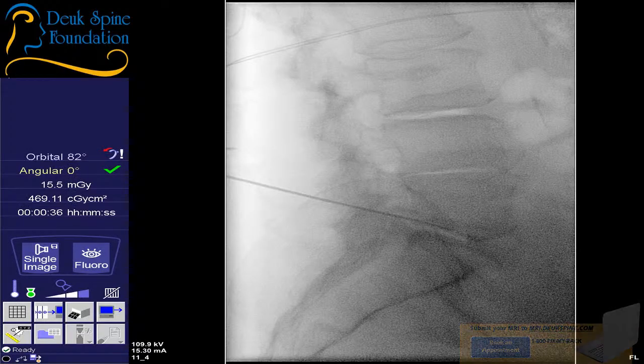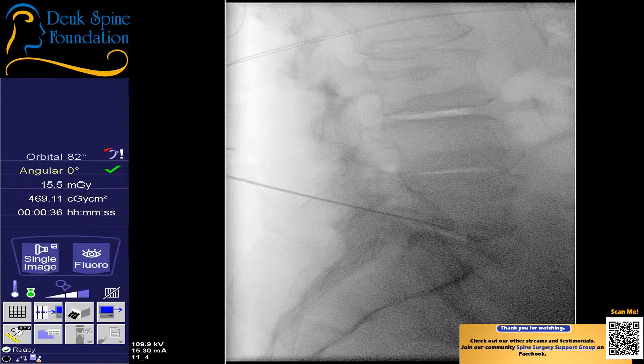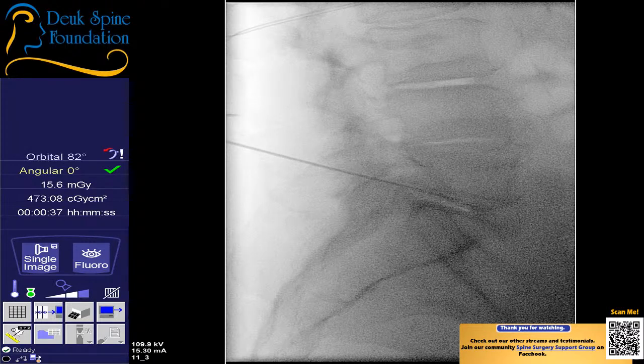So now that we're in the bottom one, and I verified that by doing a little discogram, just a tiny bit of dye, now we need to navigate to L4-5. So I need Jordan to do his job of shifting the fluoro so that the end plates of L4 and L5, the L4-L5 disc, is parallel to the beam of the fluoro machine. Look up on that last image, you could see 3-4 was parallel, but 4-5 was not. So we could do 3-4 and then come back and do 4-5. So let's go ahead and go back to where you were. It's not far from where you are now. Take a shot. And maybe we'll just do 3-4 real quick since we've got it lined up beautifully.